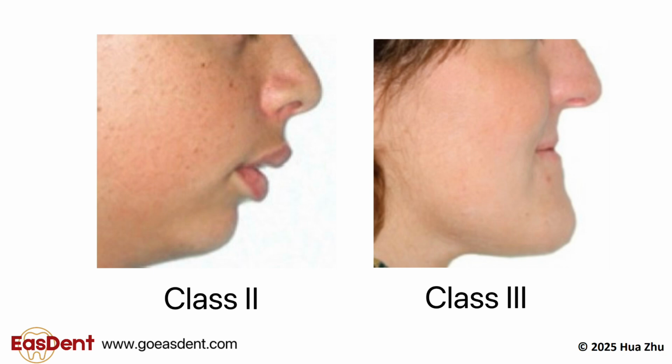It is good for patients with a class 1 jaw relationship. However, class 2 patients' mandibles are smaller. You can reduce the preset VDO a couple of millimeters from the measurement. Class 3 patients' jaws are bigger. You can add several millimeters.